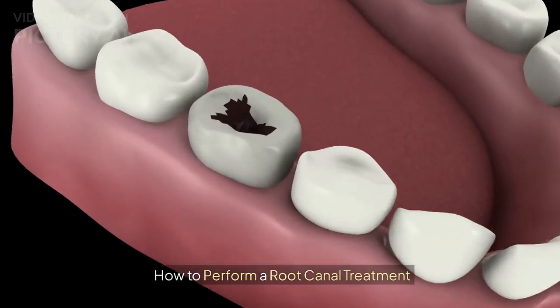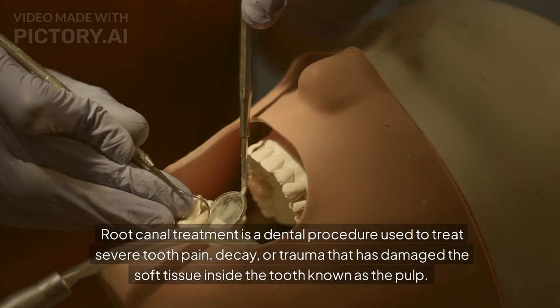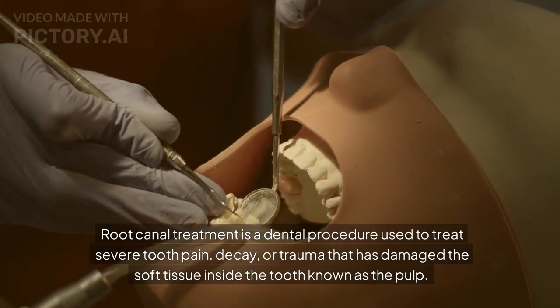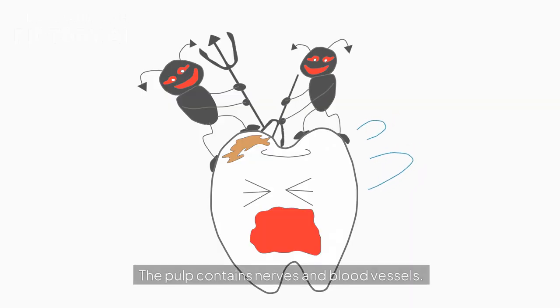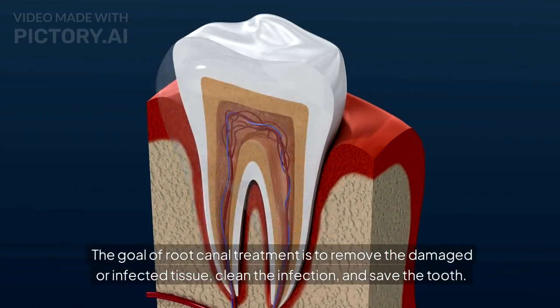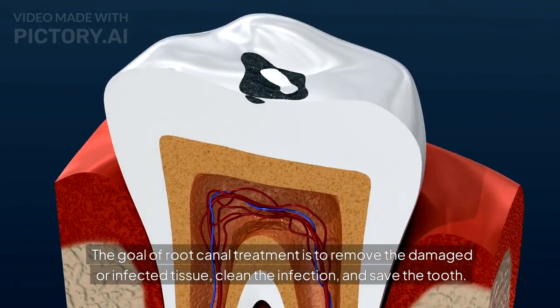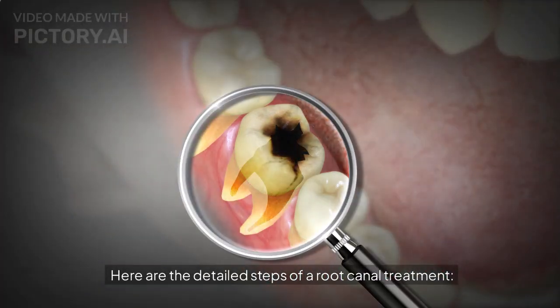How to perform a root canal treatment. Root canal treatment is a dental procedure used to treat severe tooth pain, decay, or trauma that has damaged the soft tissue inside the tooth known as the pulp. The pulp contains nerves and blood vessels. The goal of root canal treatment is to remove the damaged or infected tissue, clean the infection, and save the tooth. Here are the detailed steps of a root canal treatment.